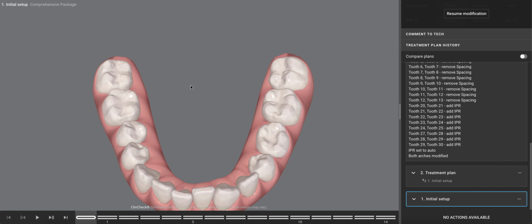And as we know, airway situations tend to be rather relevant most of the time. With that said, class 3 patients, just based on the fact that their mandible is relatively forward, lends itself to lower risk for airway risk. So I'm more likely to do IPR in class 3 cases because those are low risk airway situations.